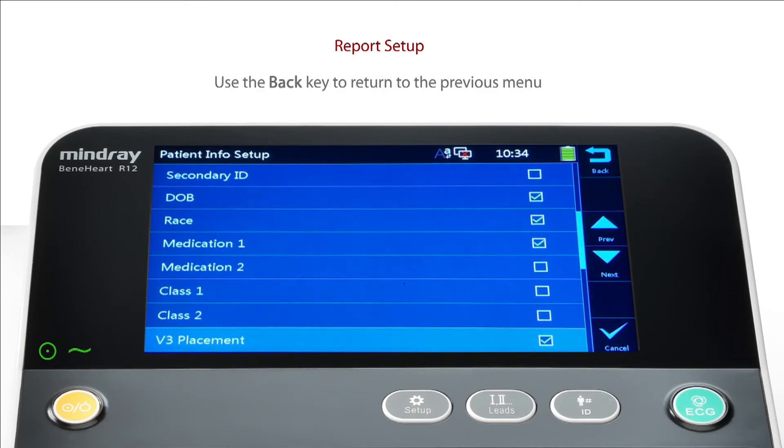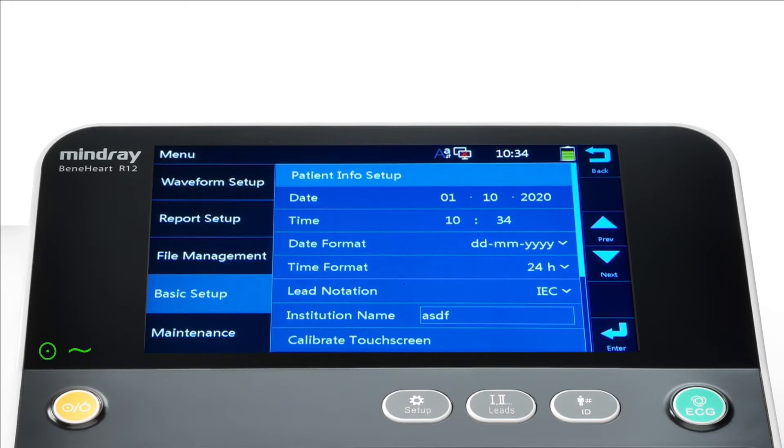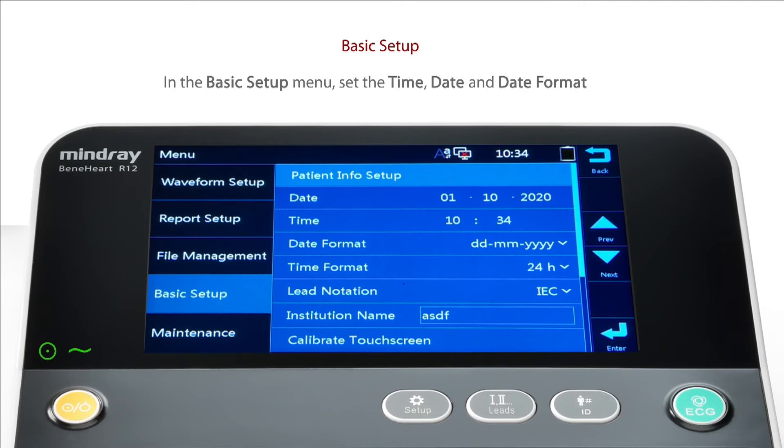On completion, use the back key to return to the previous menu. In the Basic Setup menu, set the time, date and date format as follows.